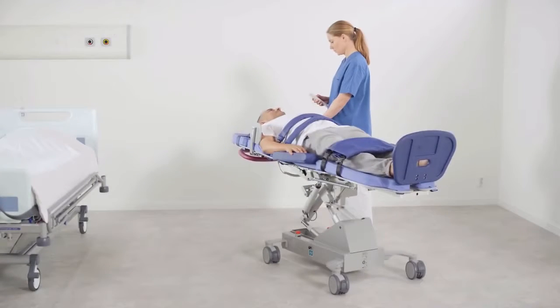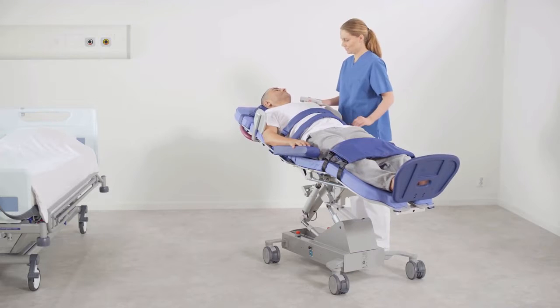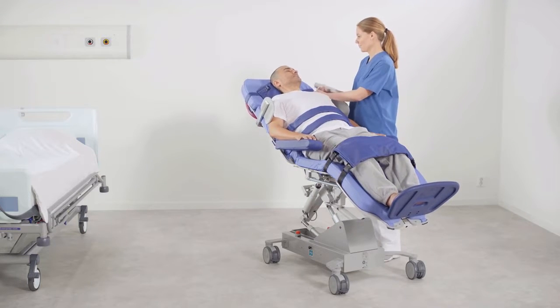Ensure that normal mode is activated on the control panel. Chair position is used to place the patient in a sitting position. Check the knee safety belt. Loosen the belt during repositioning if necessary.